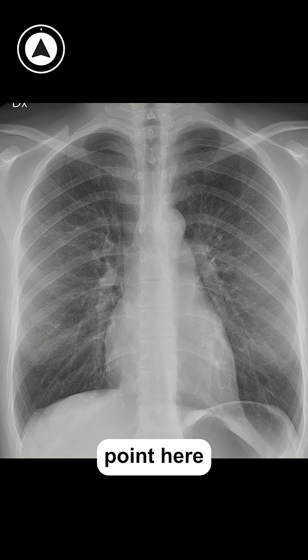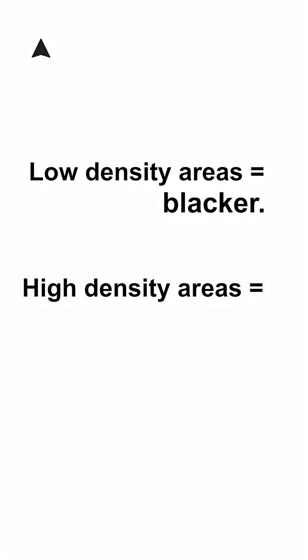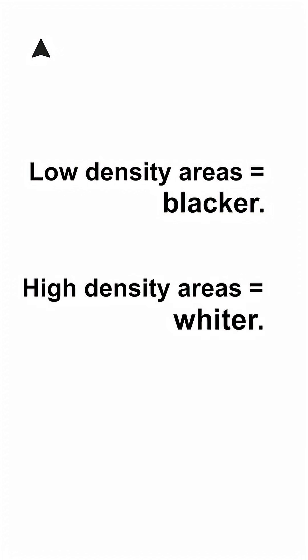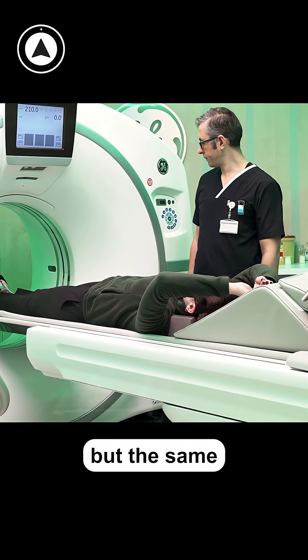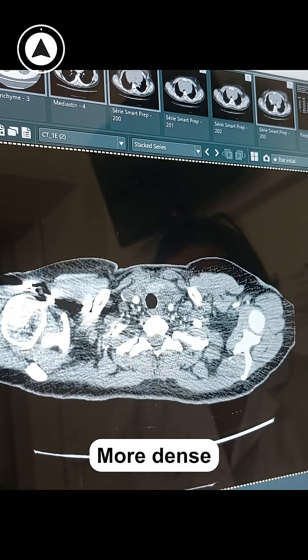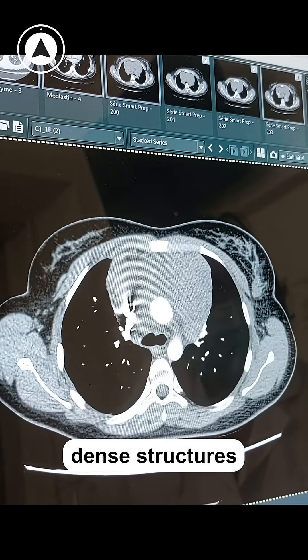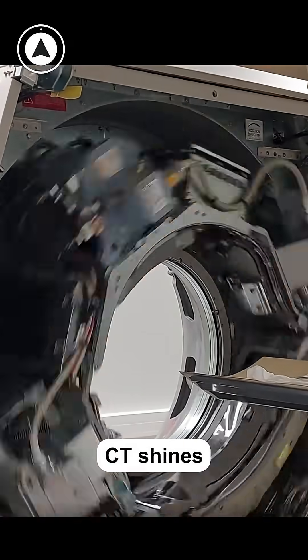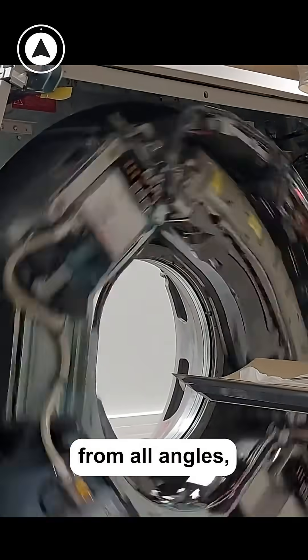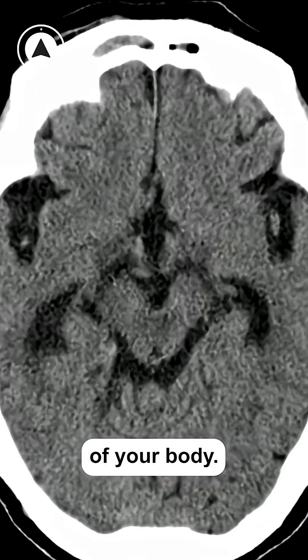The takeaway point is that low density areas are going to look blacker and higher density areas are going to look whiter. CT is more complex than x-ray but the same principles apply — more dense structures are going to look whiter and less dense structures are going to look darker. In the most basic terms, CT shines x-rays through the body from all angles and is able to determine the density of every single part of your body.